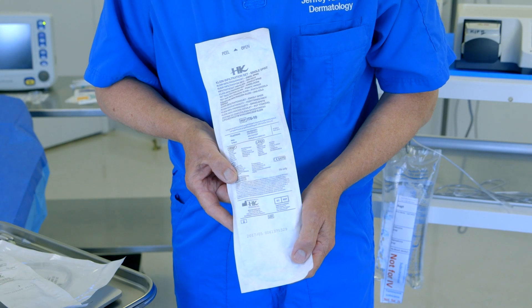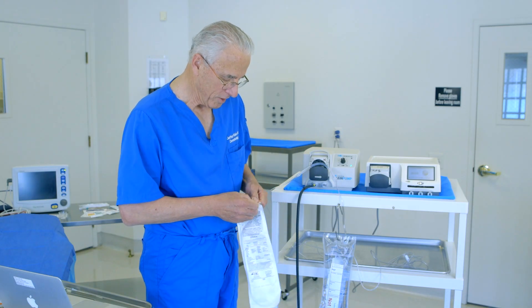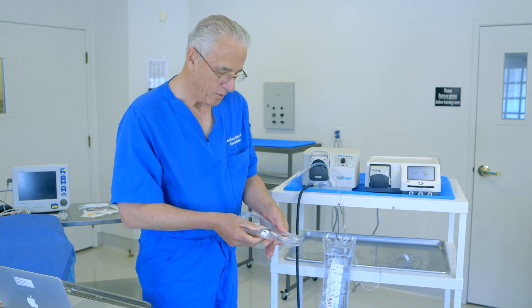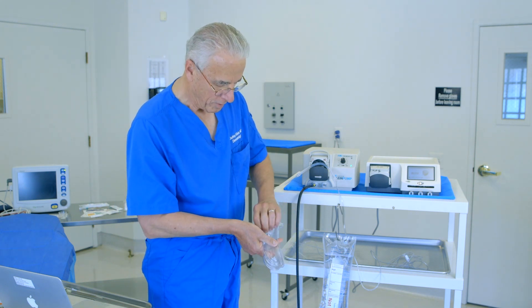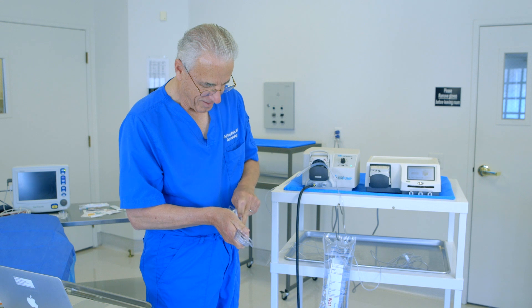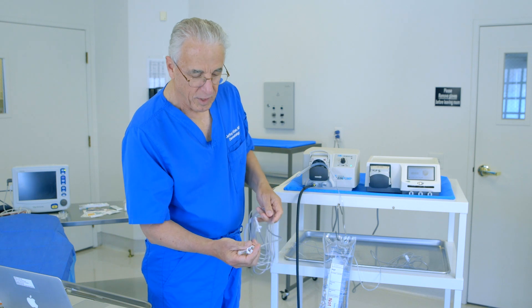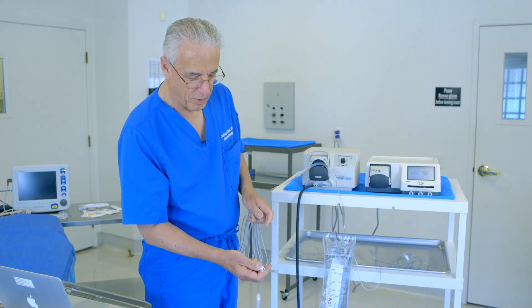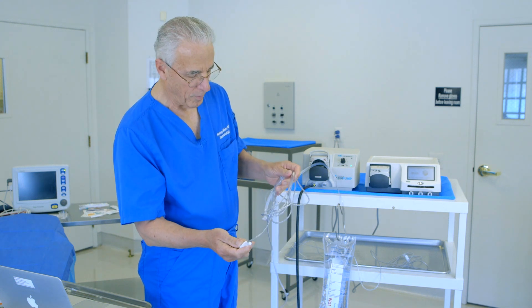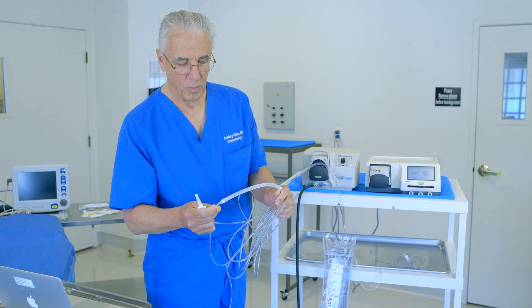Here is an example of a single spike infiltration tubing produced by HK Surgical. We open this up — it comes sterile — and here is the tubing as it comes out. I take the wrappings off, and the tubing has a clip on one side, a pinch clamp, and on the other end is the IV spike for the IV bag. This is the silicone tubing portion that goes into the peristaltic pump.